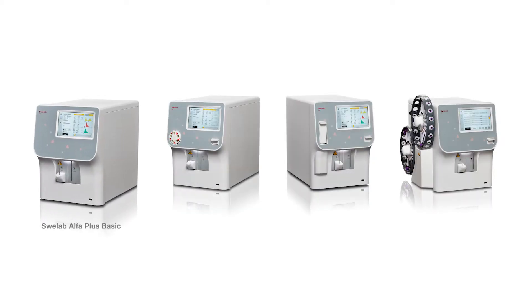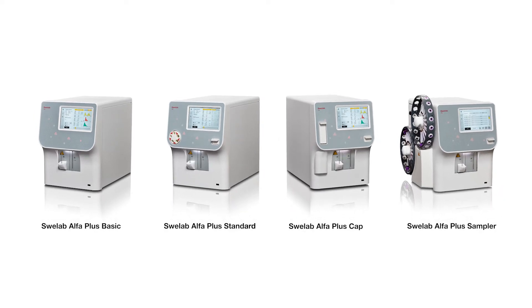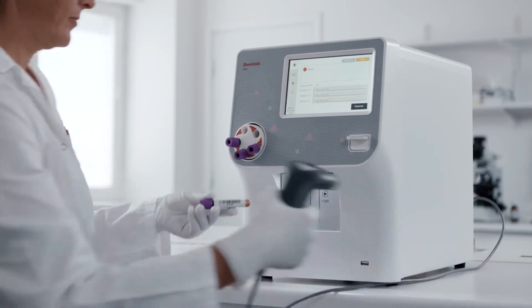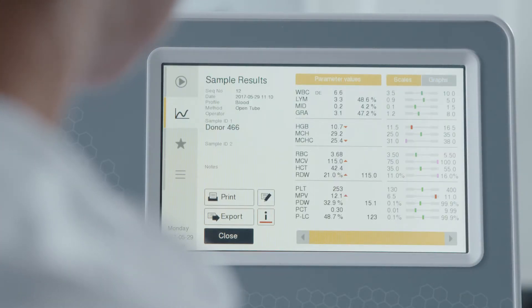Four different models are available: Alfa Plus Basic, Standard, Cap, and Sampler. Each is better equipped than ever to deliver results you can trust. Operating Swelab Alfa Plus is simple and straightforward — the intuitive touchscreen clearly shows the menu options available.